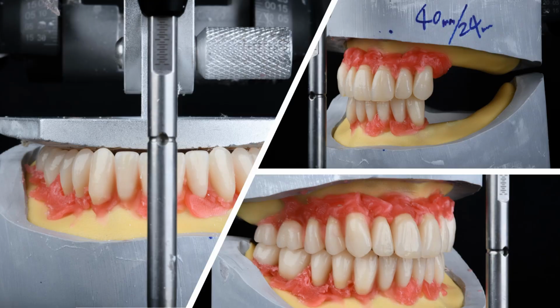The denture is then fabricated and checked in wax for fit, aesthetics, and functionality. I recommend wax denture try-ins to ensure proper lip support and bite alignment. Although a busy dentist may skip this, as with this patient, a wax denture check is a valuable step to avoid issues with tooth position or occlusion.